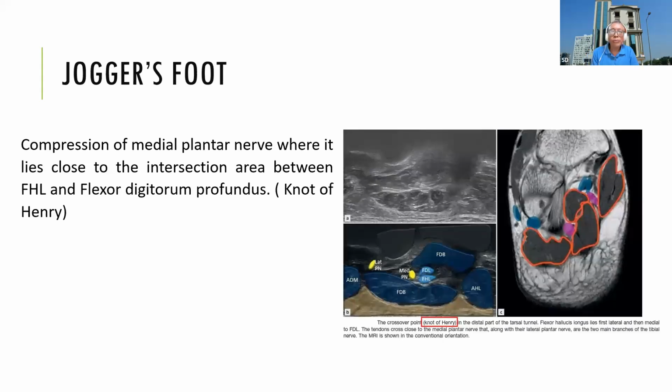So another foot pathology is jogger's foot.